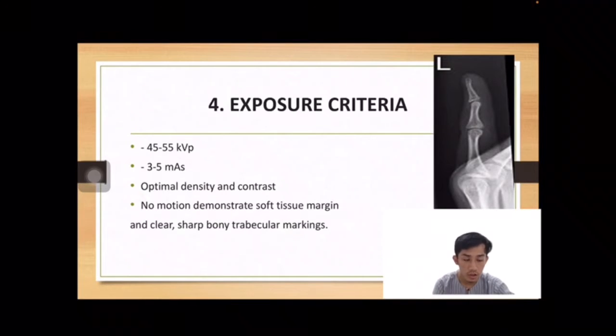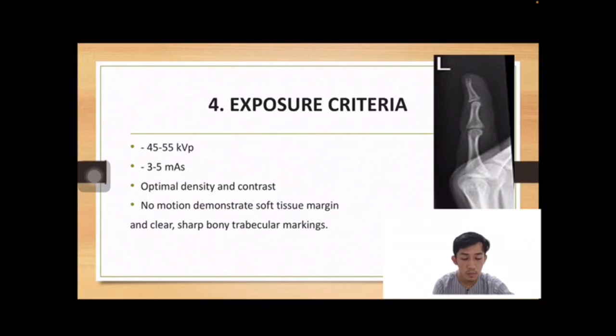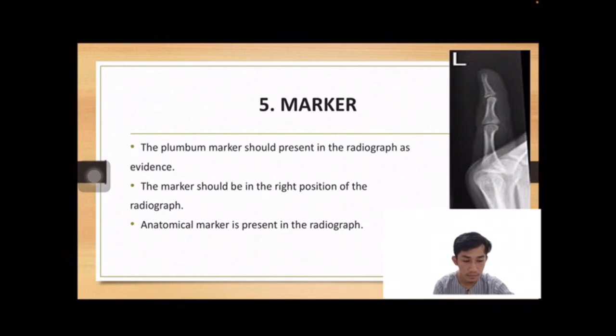Because the X-ray capture is very fast, we always advise the patient not to do any motion during the X-ray capture. So we go to the next slide.